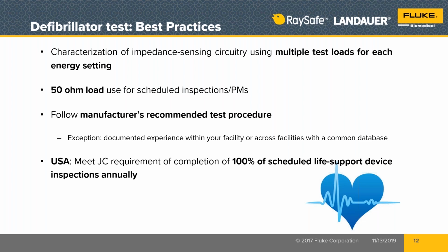But on the ACLS defibrillators, where the doctor or the nurse is dialing the energy value, we would like to know what was the energy value that you think was not delivered. And we will also bracket that if we can. So we'll test energies above and below and at that value, whatever it was. And the data, the measurements that we collect in our testing, will be what we use.